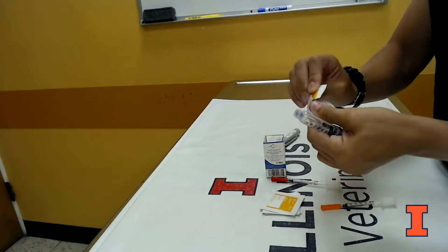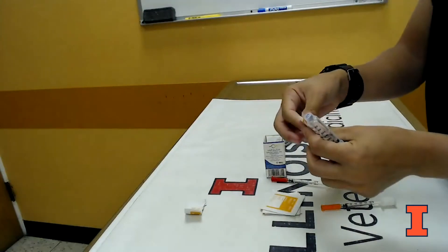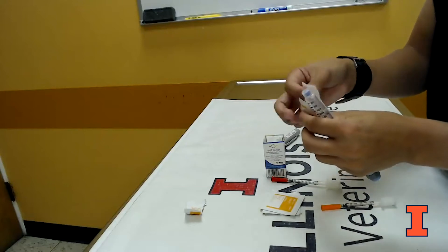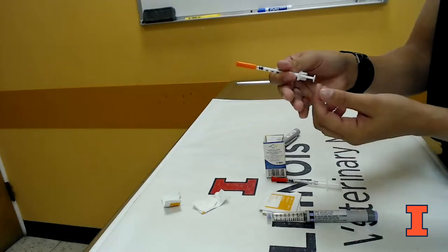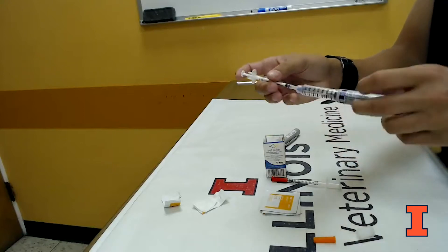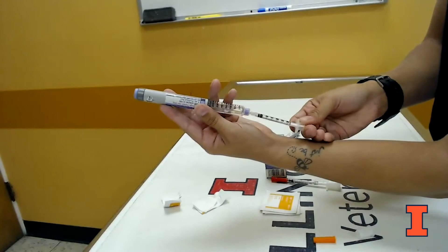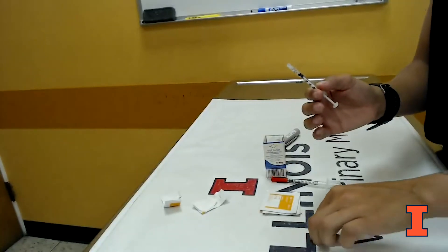I'm going to show you how we would do that. Ideally, if you have an alcohol swab available, you'd like to clean the top to make sure you're not getting any contamination. You'll need to take the cap off the end of your syringe, then insert the needle into the pen and invert it, drawing up to the correct dosage. This will then be ready to be given to your pet.